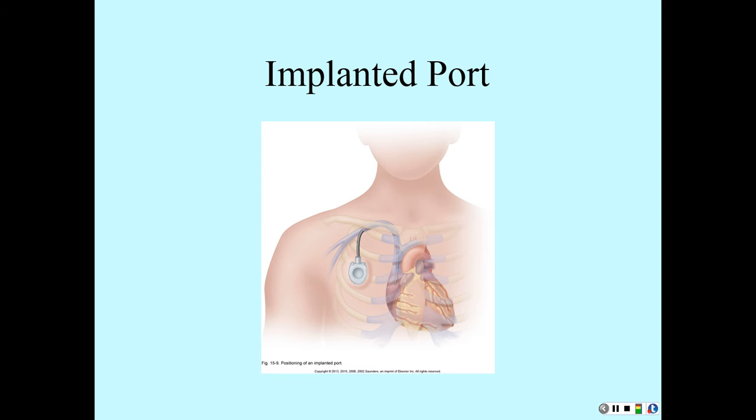These are for your folks who need long-term IV therapy, usually chemo or antibiotic. But they don't have anything hanging out. It's all up under the skin.